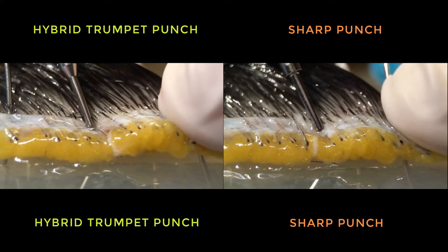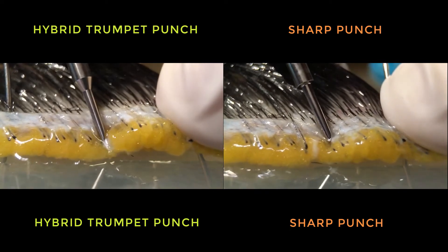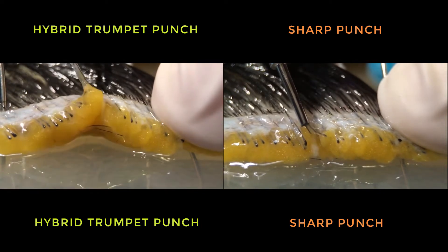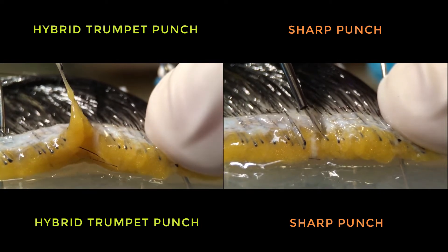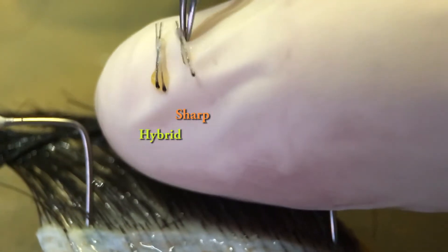The video clearly draws a comparison between sharp and hybrid trumpet punches. The former cuts the skin and the hair, while the latter strokes them. With the hybrid trumpet punch, hair slides inside it and the paring and transection rates are reduced to their minimum.